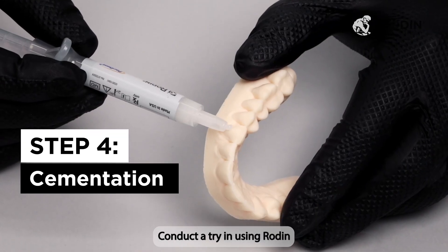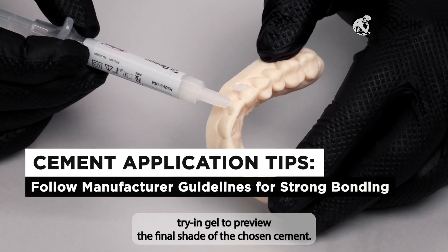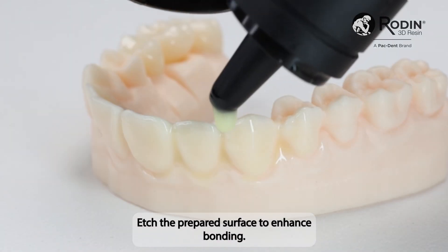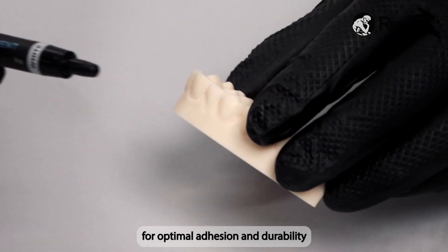Before final cementation, conduct a try-in using Rodin Try-In Gel to preview the final shade of the chosen cement. Etch the prepared surface to enhance bonding, then apply Rodin Bond followed by Rodin Veneer Cement for optimal adhesion and durability.